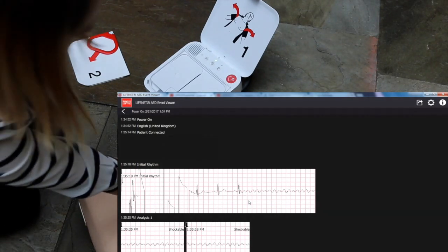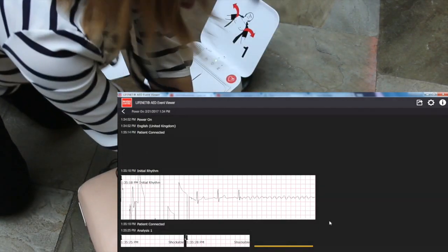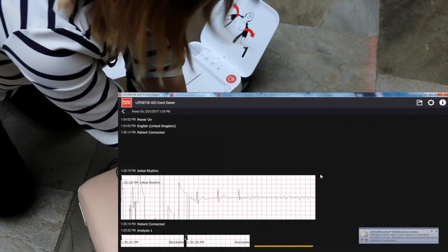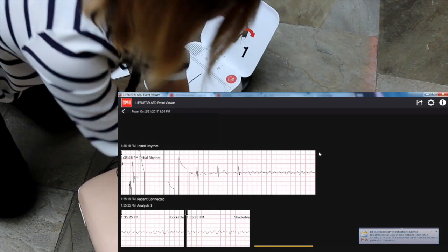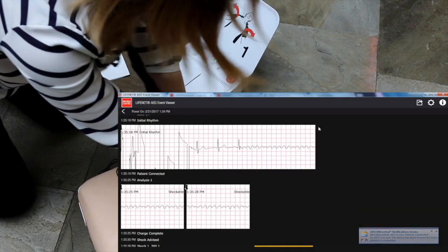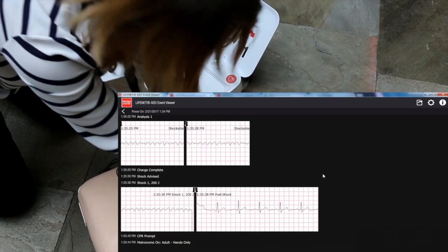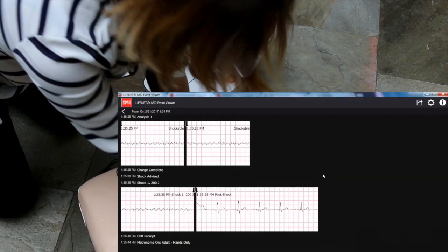The heel of one hand should be in center of chest. The other hand should be on top of first hand. Push down hard at least 5 centimeters. Lean over the patient. Keep elbows straight. Use body weight to push.